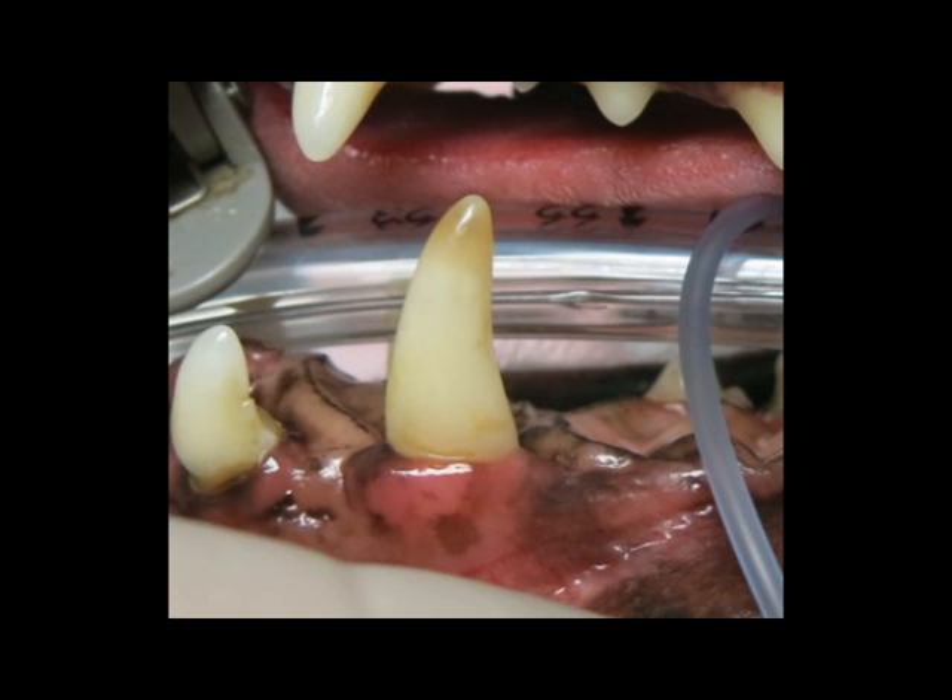This is our patient anesthetized and lying on her back. She has a tube in her windpipe to protect her lungs and she's ready for surgery to save her right upper canine, or fang tooth. It looks normal on the outside of her mouth as the owner was brushing the outside, but the advice she had received from some YouTube videos was that it was okay not to brush the inside of the mouth, so the inside of the teeth were not brushed. That was wrong advice.